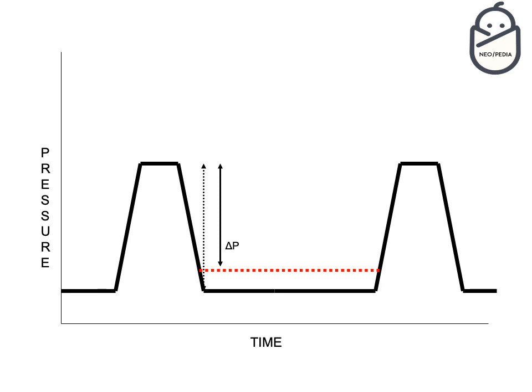Okay, so if you reduce your delta P, you have reduced your CO2 clearance, and you remember the CO2 was only 4.5 in this condition. Okay, and you have helped with oxygenation at the same time, because you have increased the area below the curve, which is really helping the oxygenation in this condition. Okay.